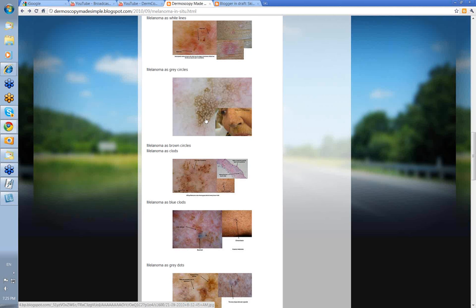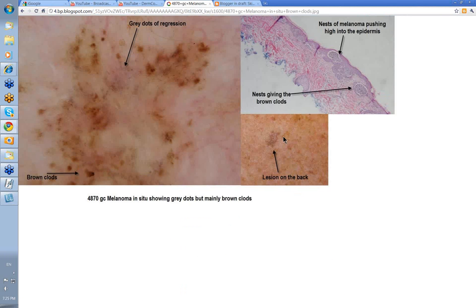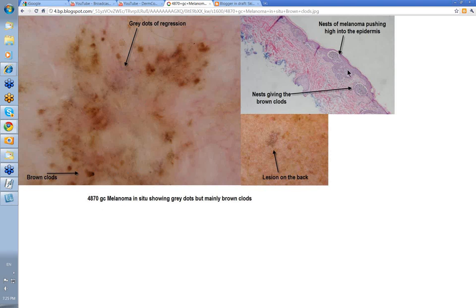Melanoma's clods. This was a lesion on a man's back. Here there are actually quite a few grey dots within this. Grey dots are always quite useful as a marker of melanoma — they indicate regression, they indicate something's going on there. There were brown clods down here, so this was melanoma in situ with brown clods. There are a lot more brown clods in the other part of this lesion. The clods are due to nests of cells — this one is pushing high into the epidermis, this one at the dermoepidermal junction. This is what gives you your brown clods when you look at it.